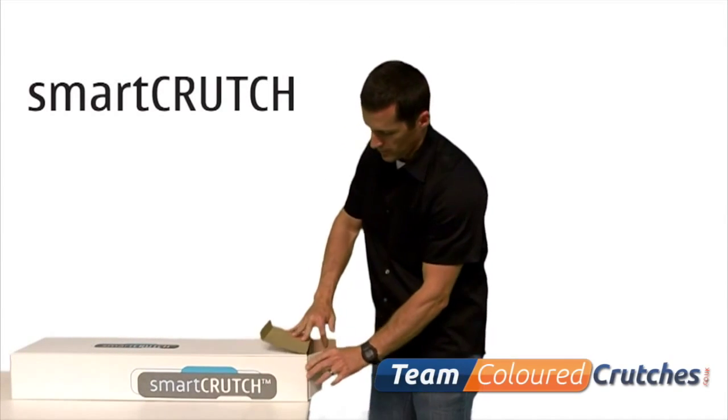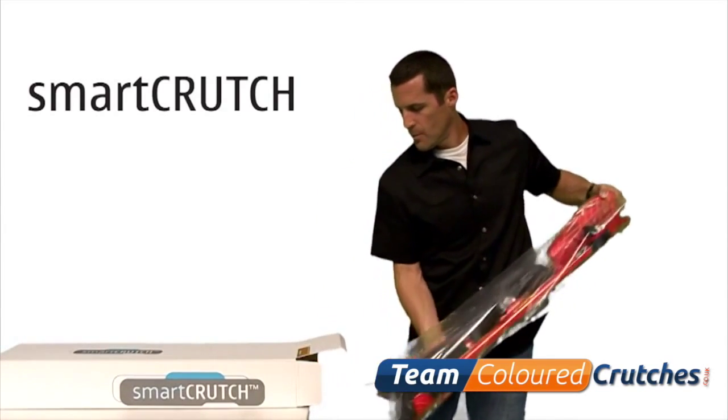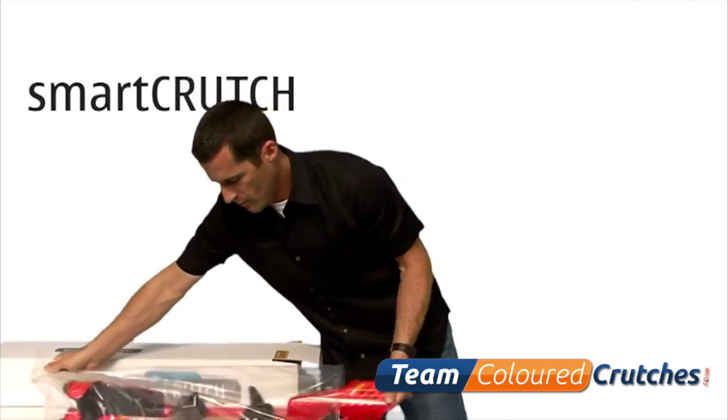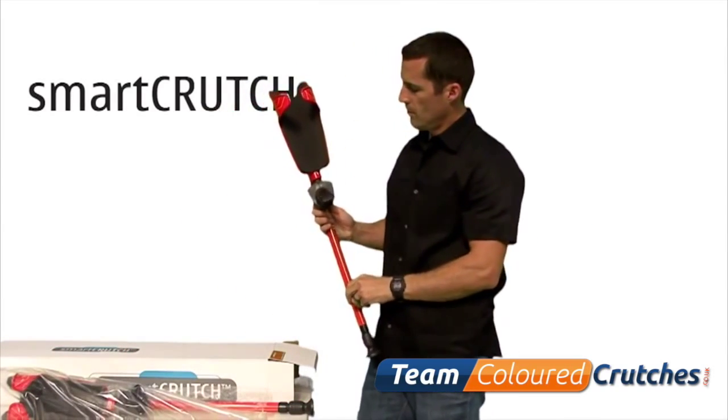How to set up your smart crutch. First, remove your new crutches from the box and packaging. You will notice that each crutch is individually marked just above the grip to indicate left or right side.